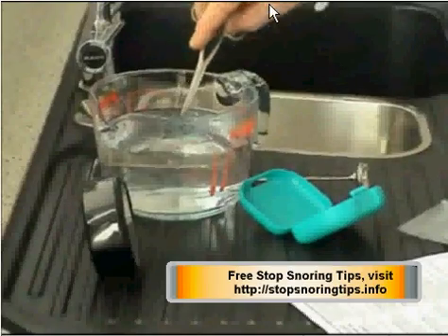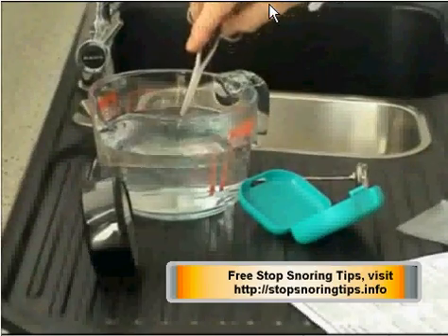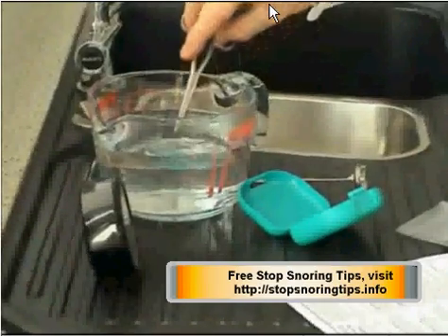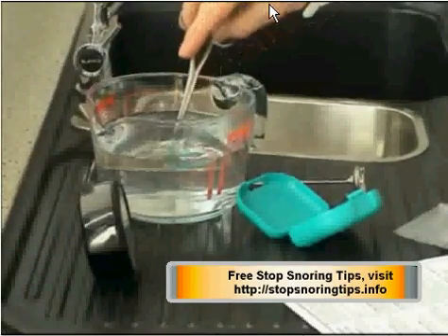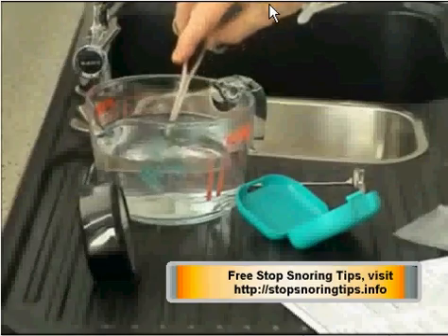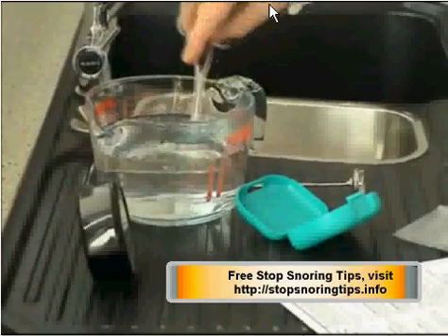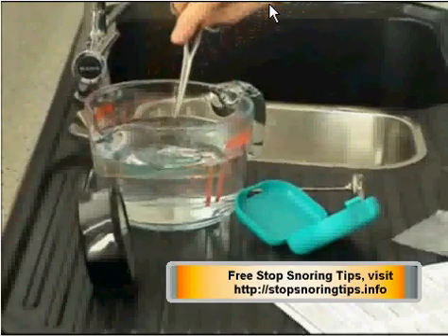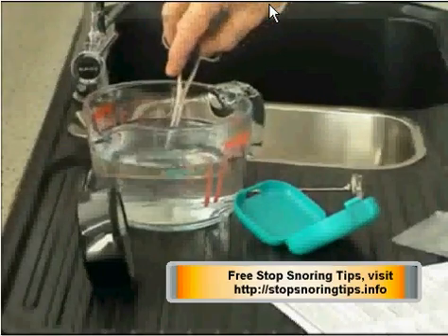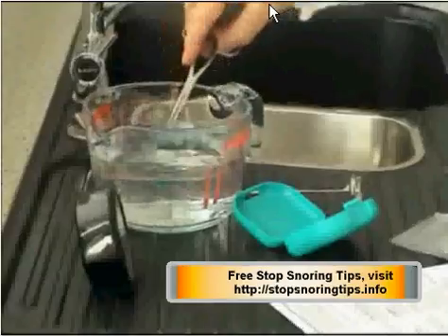So in 20 seconds time I'm going to take it out, put it in my mouth, between my teeth and my lips, and then I'm going to suck in very hard and push on the tab with my tongue. I need to make sure I know which way is up. And then bring the holes in the bottom. Exactly 1 minute.